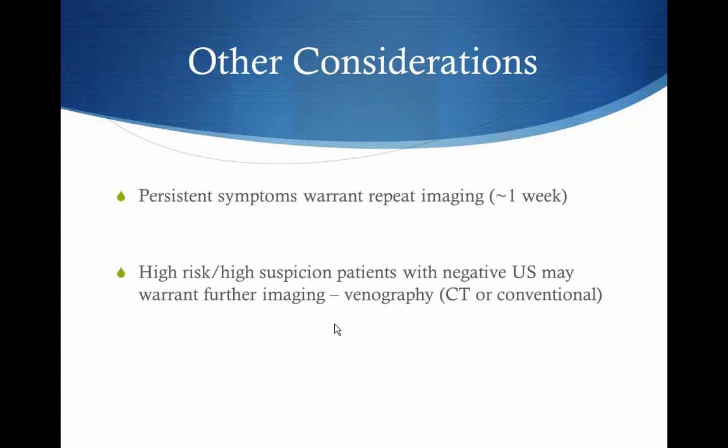Some other things to think about: if you have a patient and you do a study on them and it's negative, almost everybody should have follow-up. If they have persistent symptoms, they should probably have repeat imaging. Roughly a week is what I usually tell people.